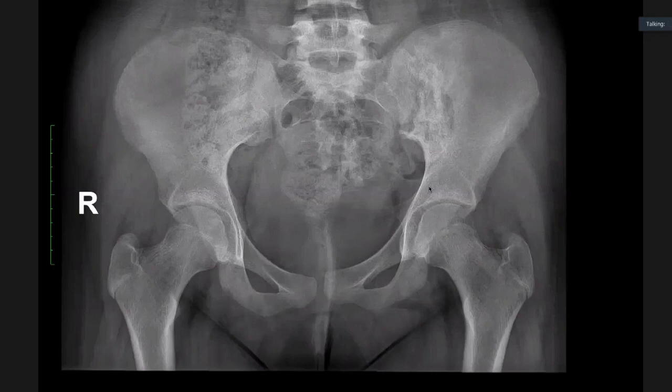process can give you this appearance? So whenever you look at a bone abnormality, you think about neoplastic. Yes. What else? So it can be infective. Yeah. Okay. Good. Yeah, it can be infective. And sir, it can be eosinophilic granuloma. Well, that again, you're going towards a neoplastic lesion, isn't it?